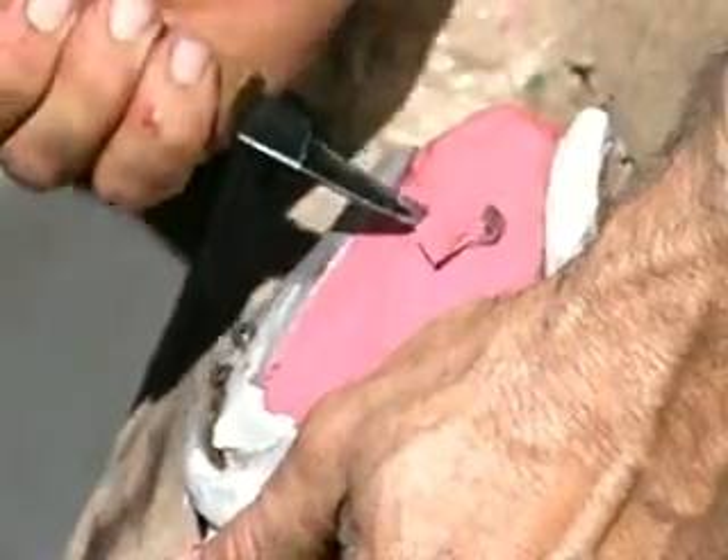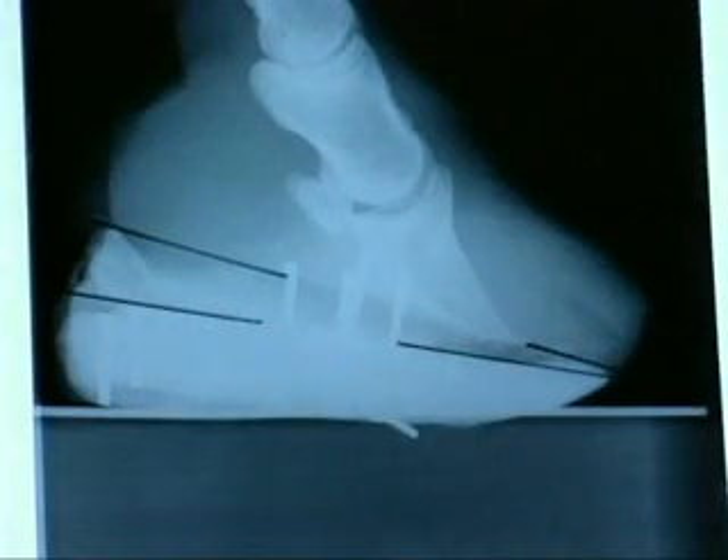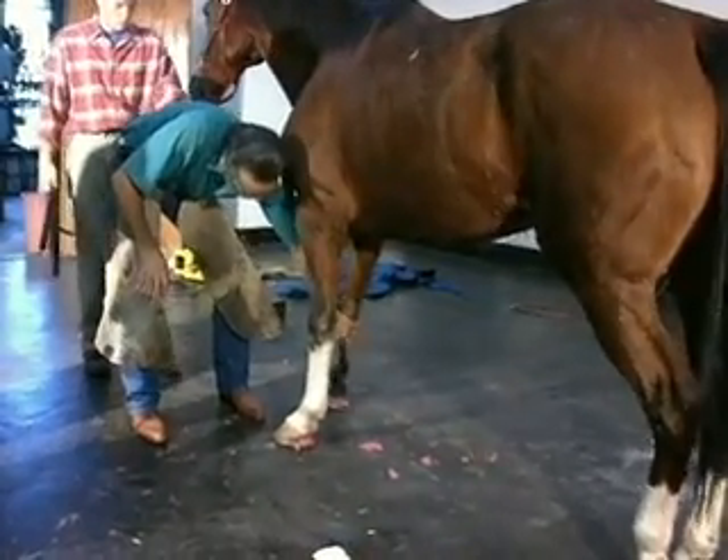With a horse that has a very long toe with chronic rotation, it's quite often to see three inches of toe forward of the shoe once you've placed it on. Notice the lines we've drawn here — we want those lines to be parallel with our application. This will unload the apex, as you see here. Slight differences will make a tremendous difference for the healing process.